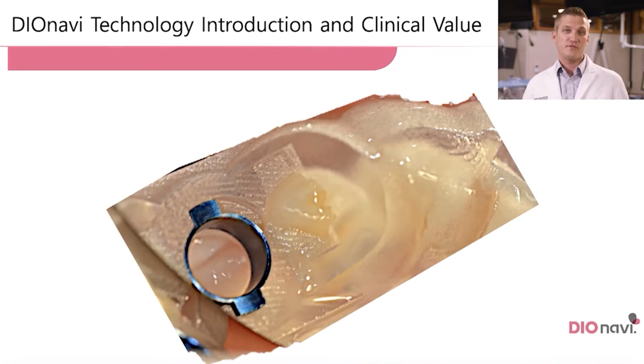This really is a unique thing about DIOnavi. Their guides fit remarkably. Like I said, I had worked with lots and lots of different implant companies, different guide companies and labs, and I've never seen a guide fit with the precision and the accuracy of the DIOnavi system. It's a wonderful fitting guide to see it perfectly marry itself with the anatomical structure of our clinical crowns or our soft tissue guides. It's a very, very well-fitting guide.